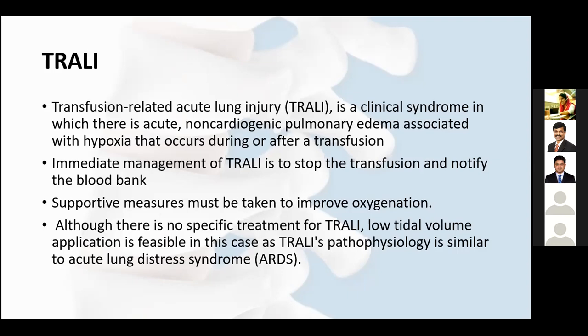Let me just explain in simple ways about this cell salvage machine, blood salvage. It's actually a suction. It sucks in blood and keeps it in a suction bottle-like thing. It has a disposable membrane filter, where after the end of the surgery, it keeps the RBCs and washes away other cell debris, WBCs and everything. And then it is put in a centrifuge machine so that the RBCs alone are collected. The collected blood will contain only RBCs with oxygen-rich blood, so it can be transfused to the patient immediately.